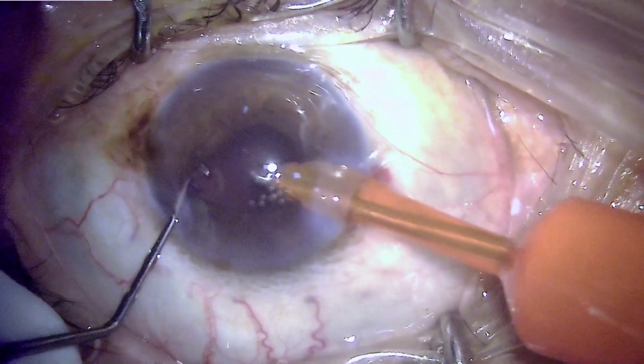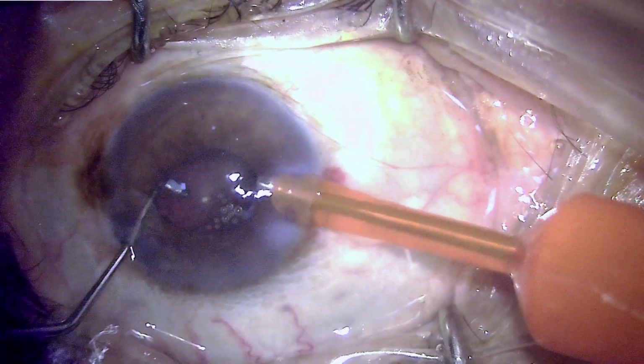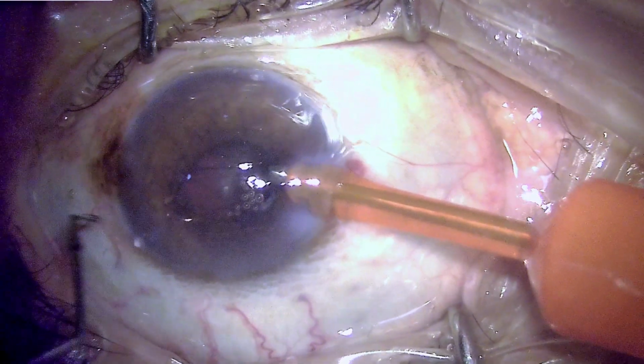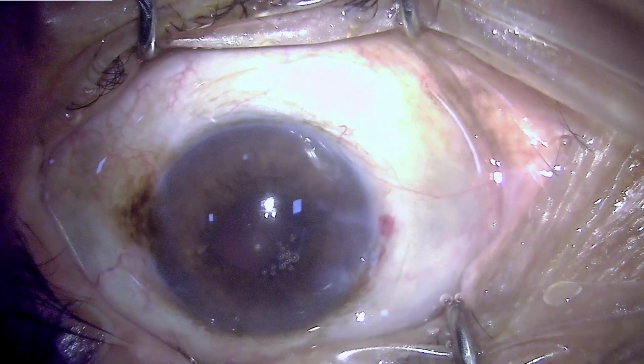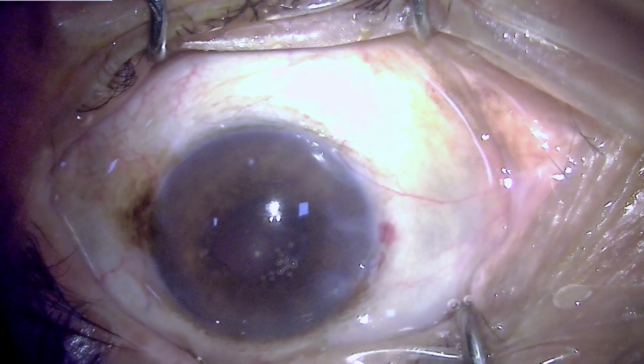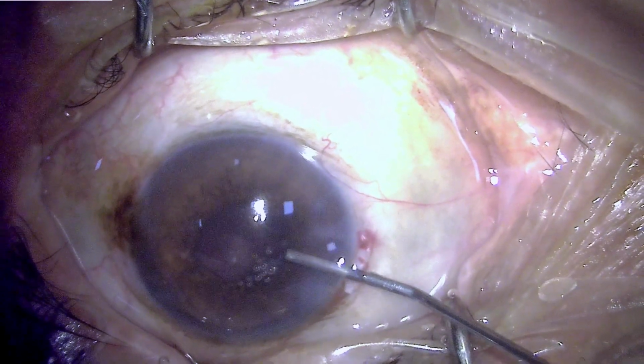One has to keep the movement restricted to the center so as not to engage the pupil or the iris surface. Once the nucleus is gone, we have to come out with the irrigation off, so that there is no increased pressure and the iris prolapse can be reposited back.